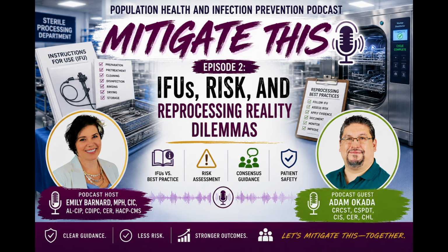important step, because a lot of hospitals have one source, which is an online database for IFUs. But I've seen a lot of users who don't know how to log into it. They've never been inside their account. And that's a little bit scary because they should be going in there all the time. So those types of questions will open up other questions. And that's how you learn the wonderful and terrifying world of sterile processing.